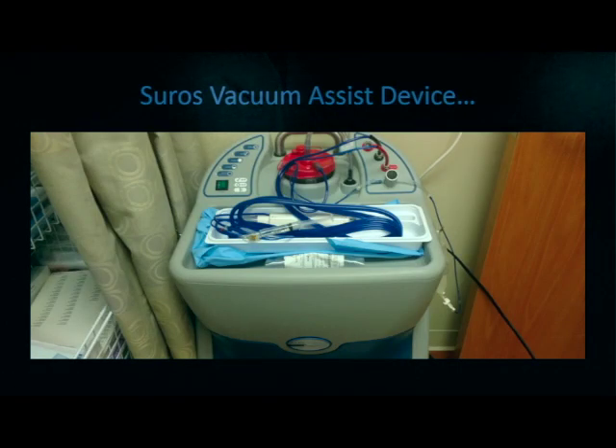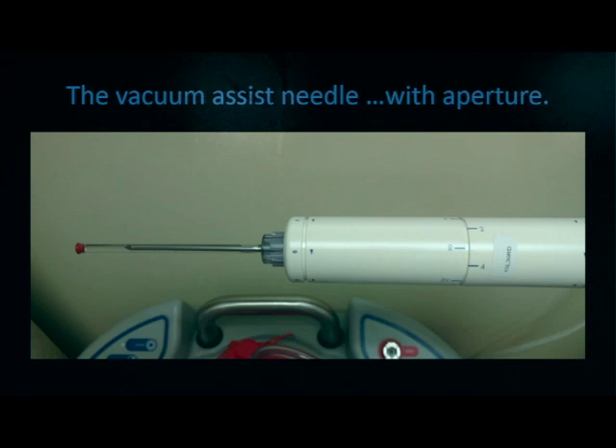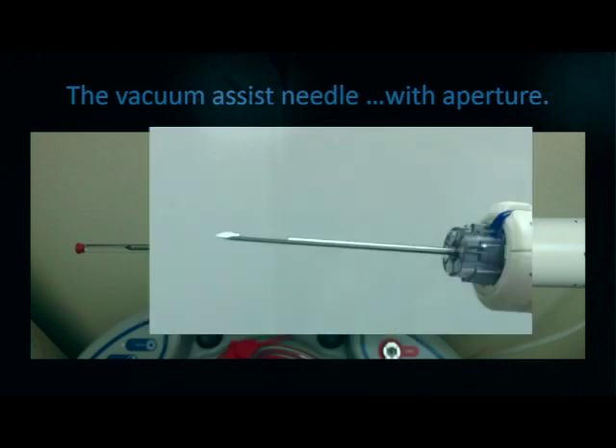Often, biopsies will be performed with a vacuum assist device, which is depicted here. This device uses a high gauge needle as well as vacuum suction to obtain tissue. Here we see the needle and the aperture that tissue would be placed in with vacuum assistance.